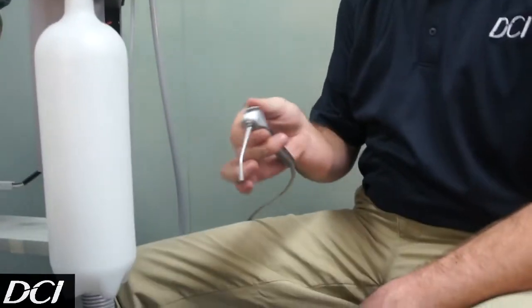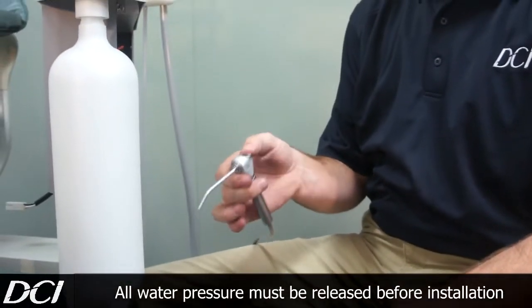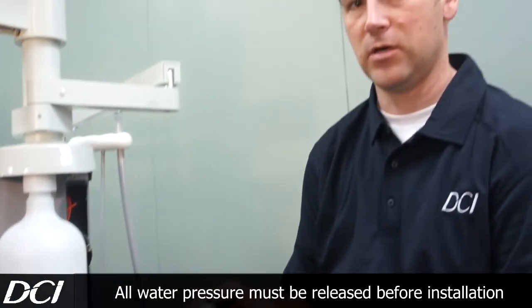From there, you're going to go ahead and take your syringe and just go ahead and run it. This one's already bled out, but make sure there's no air or water pressure left coming out of your syringe. It lets you know all the pressure's gone.